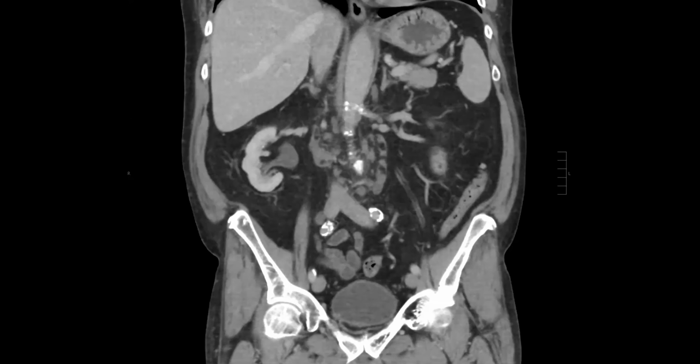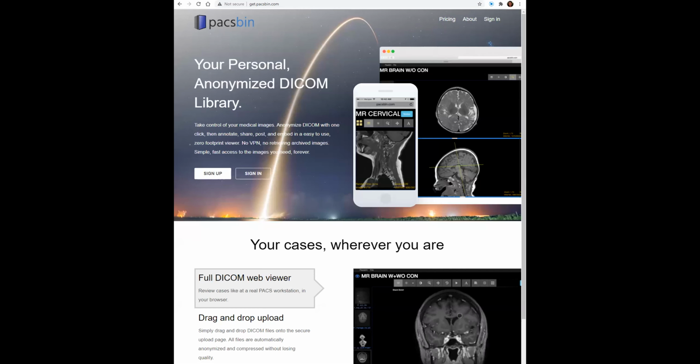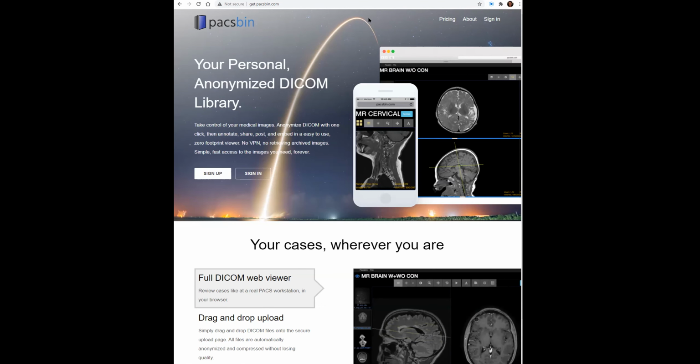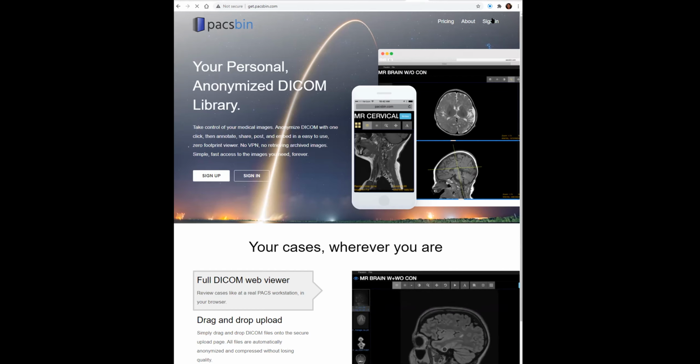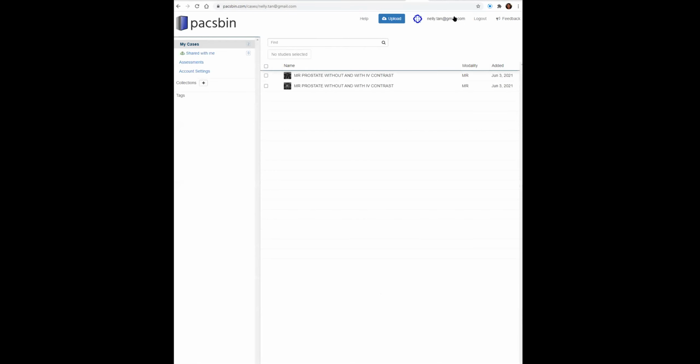Okay. So I started looking into this. Cookie and Perry did the unknown case panel at SCR, and they used this thing called PacsBin. Did you guys see this? Did you guys watch the unknown? It was awesome. And I guess it's a way to anonymize cases.